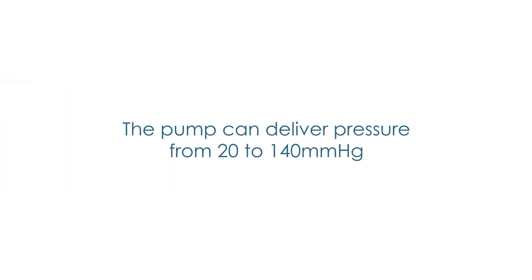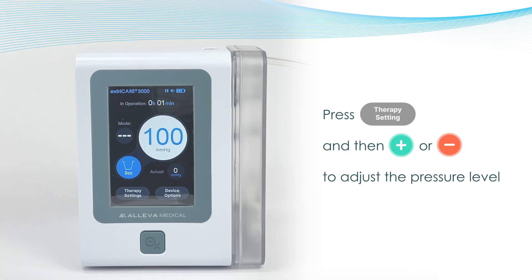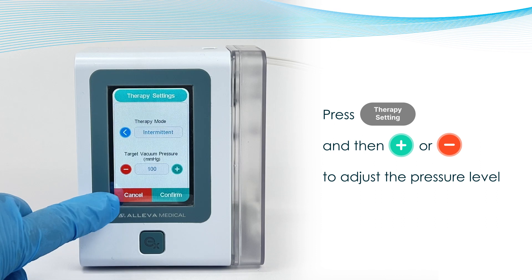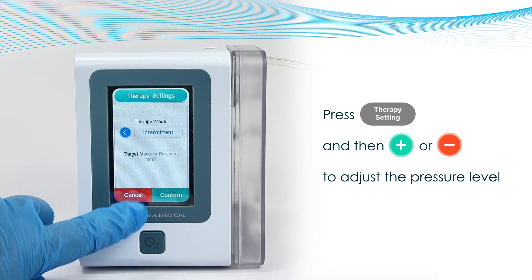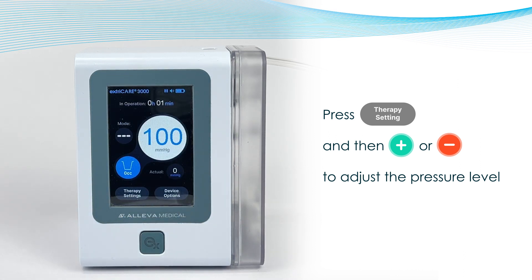Changing Pressure. The ExtraCare unit can deliver pressure from 20 to 140 mmHg. The target pressure is displayed as the larger numbers on the touch screen. To adjust pressure on the ExtraCare 3000, press down on the Therapy Settings button at the bottom left of the screen. You can adjust the pressure up and down by pressing either the green plus button or the red minus button. Each press will change the target pressure by 5 mmHg. Once the target pressure is chosen, press Confirm to return to the main page.